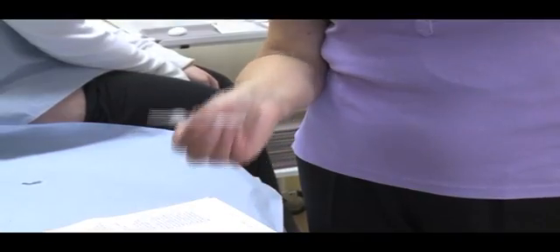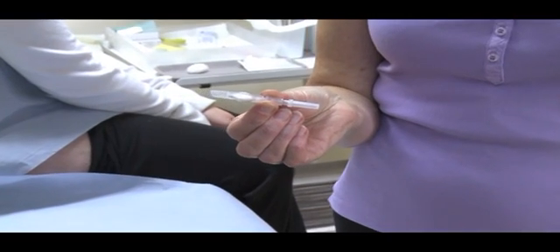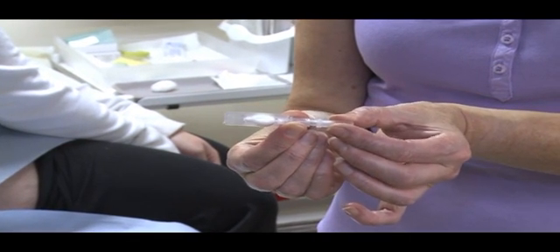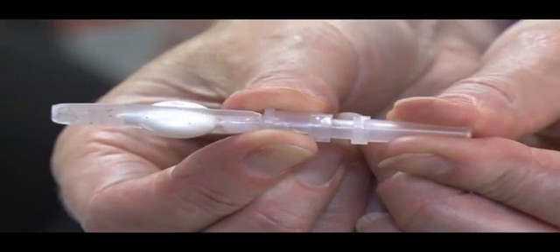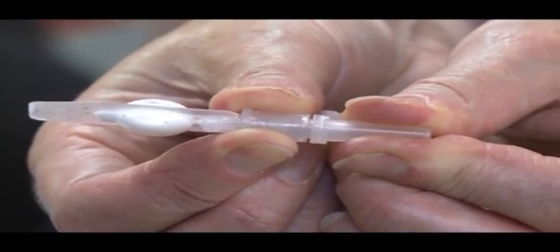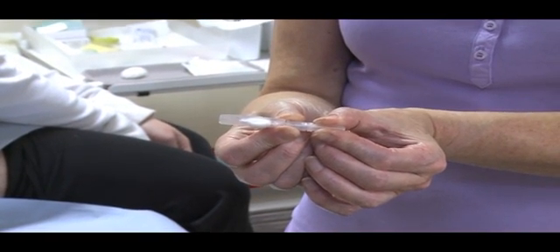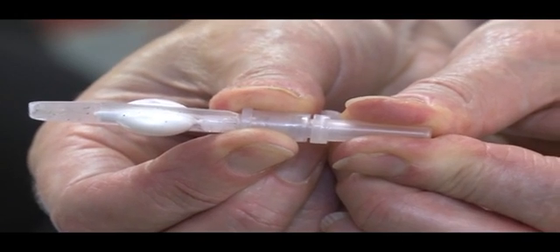Activating the injector is one of the most important steps in the injection process. Without successful activation, the injector will not work. Hold the injector firmly by the port with one hand, taking care not to squeeze the reservoir. Hold the needle shield with the other hand. You will see a gap between the port and the end of the needle shield. Push the needle shield towards the port and continue to push firmly until you close the gap. You should hear a click similar to the click you hear when placing a lid onto a pen. With the gap fully closed, the injector is now activated.